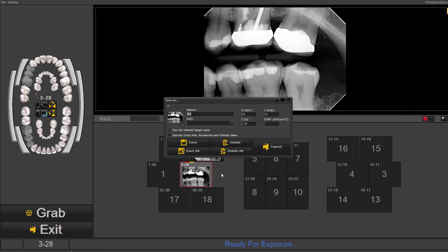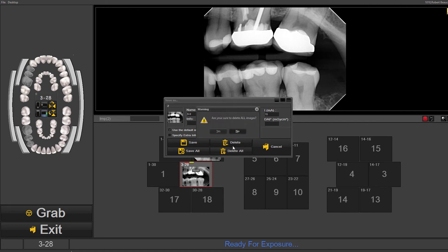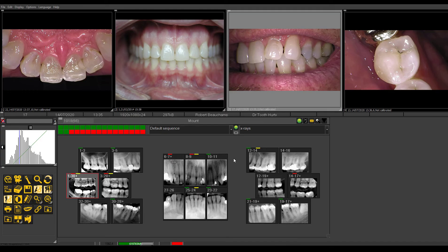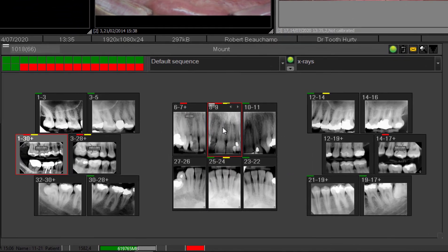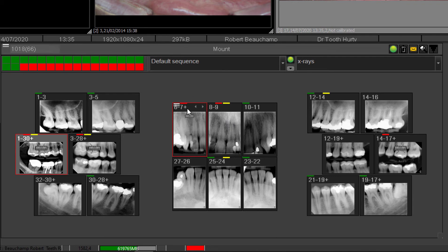When you exit, what you would do is save all. I'm not going to do this now because I have thousands of images in here, but the images would then be stored in your FMX underneath that tooth number. And if you did have multiple images, you would see that little plus sign.